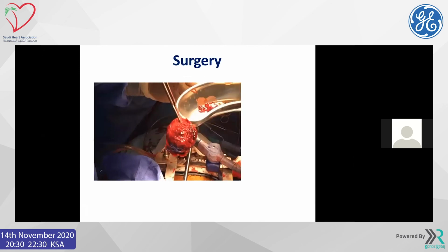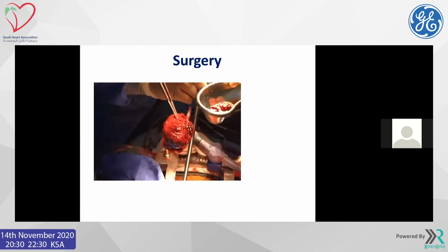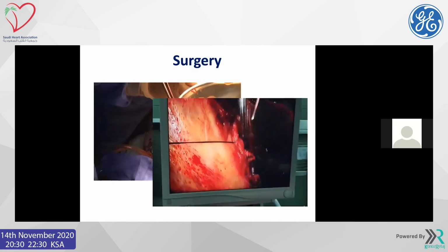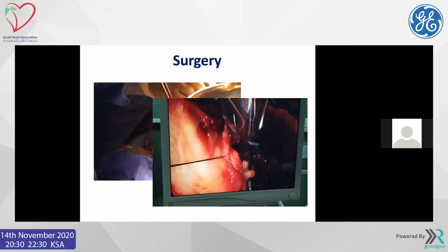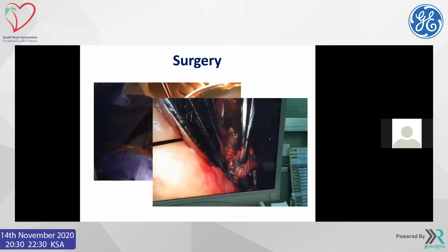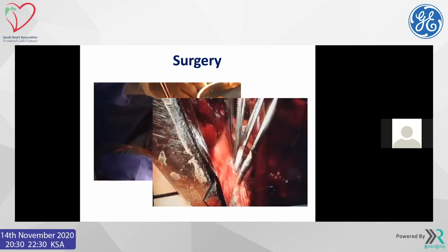And this is the surgery. They removed this pseudoaneurysm and repaired the ventricular wall with, as we see here, a patch suturing and closing the defect in the LV apex.